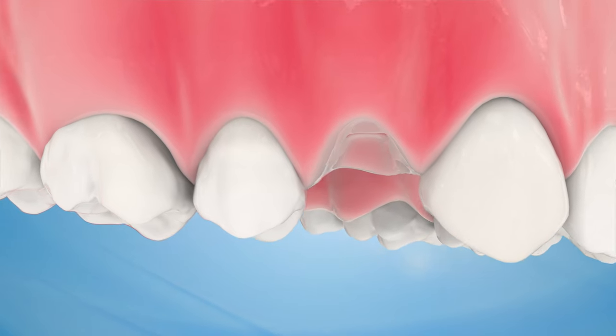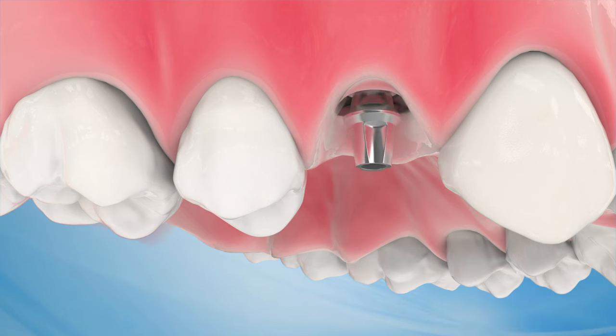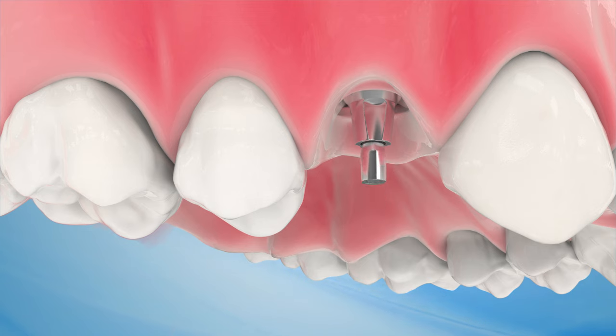An abutment is used to connect the crown to the implant. An abutment is a connector that is placed on or built into the top of the dental implant, linking the implant to the replacement tooth.